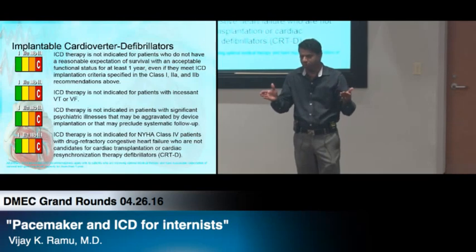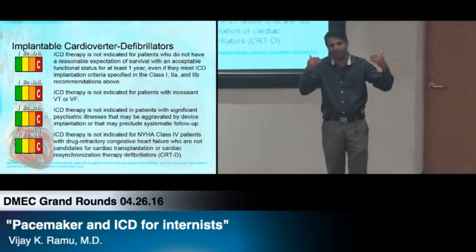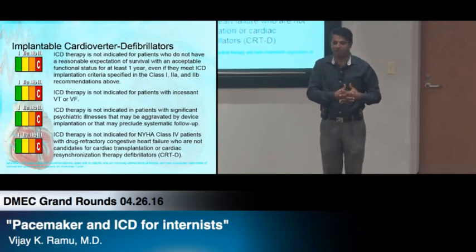So there are arguments both ways. But in the United States you're right. If I put in a pacemaker, 95% of them are dual chamber pacemakers. They don't want to take that risk. Yeah, litigation, all the stuff. In Europe, if there is no AV nodal disease, a lot of them get a single chamber atrial pacemaker. Here, if you see a single chamber atrial pacemaker, everybody is excited. Nobody puts it in. When do we actually go with a dual chamber versus a single chamber?